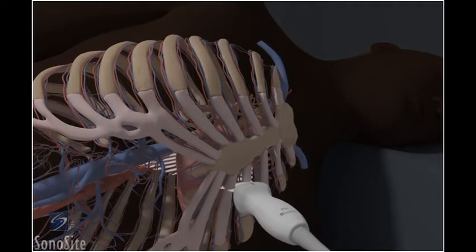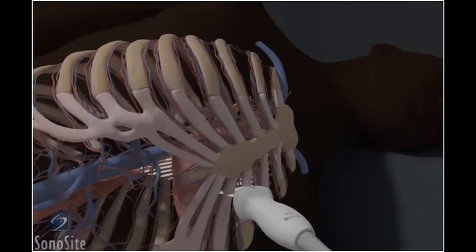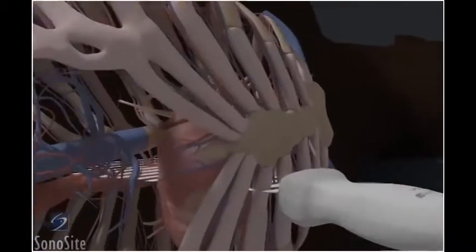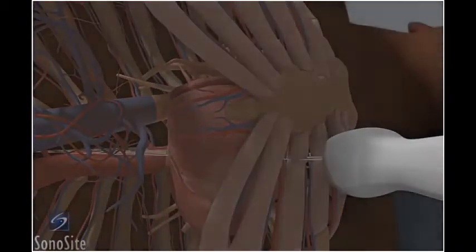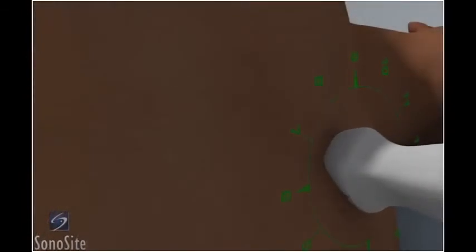Assuming the short axis of the heart to be positioned on a plane from the patient's right shoulder to the left hip, rotate the transducer to adjust for the body habitus of the patient. The orientation marker will be at approximately the two o'clock position.